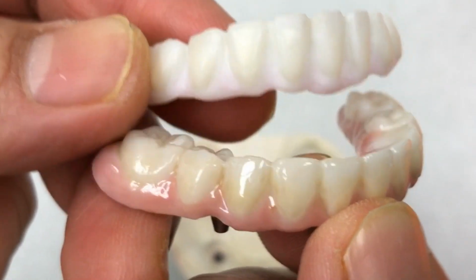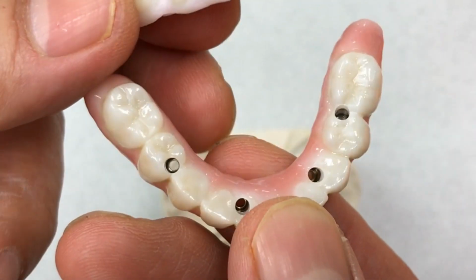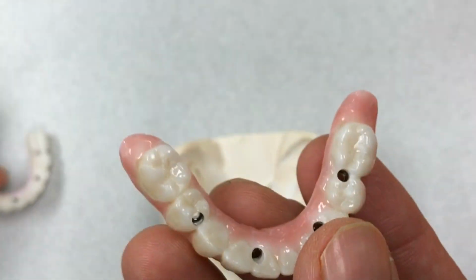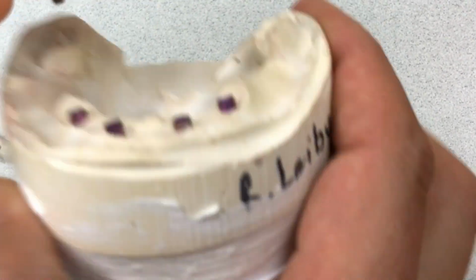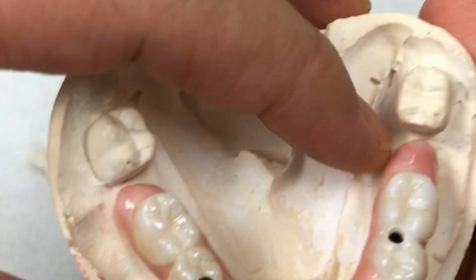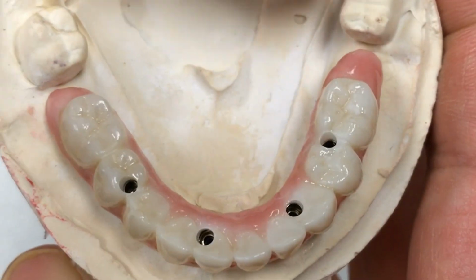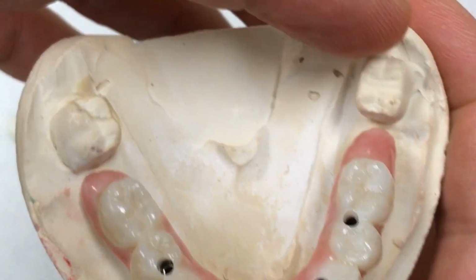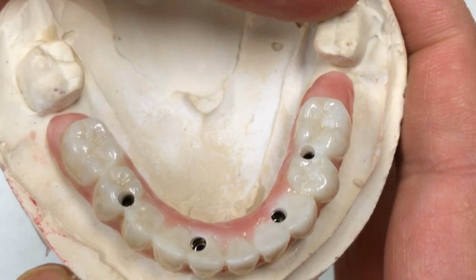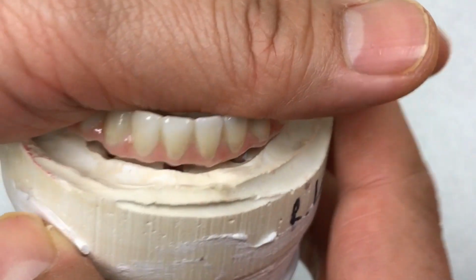Make sense to you? But the other one, the molar, is monolithic. So we follow the prescription path, and then we try to leave it this way because to me it's not necessary. Probably they're trying to prevent this tooth from tilting more medially. They don't want to rub it. Anyway, the finished restorations.